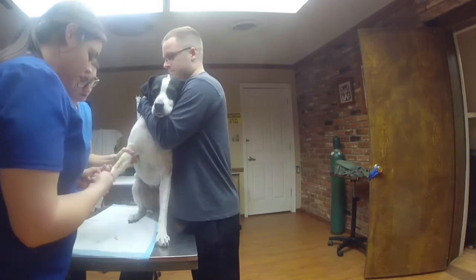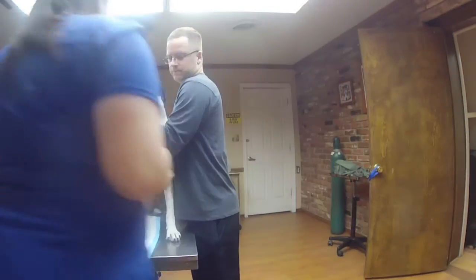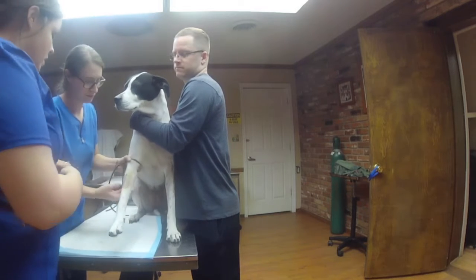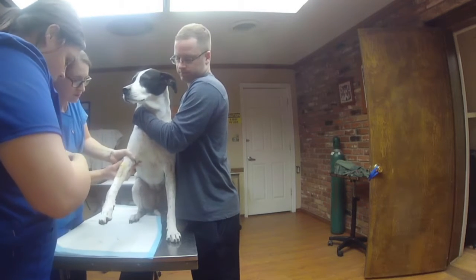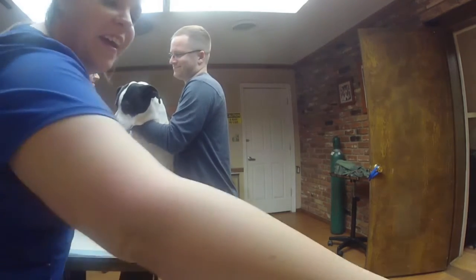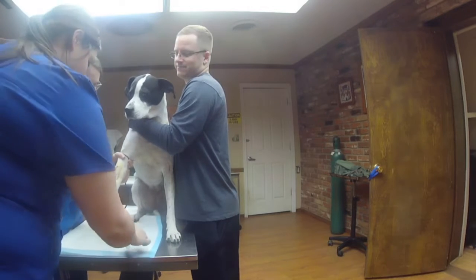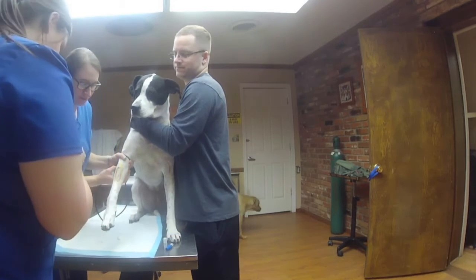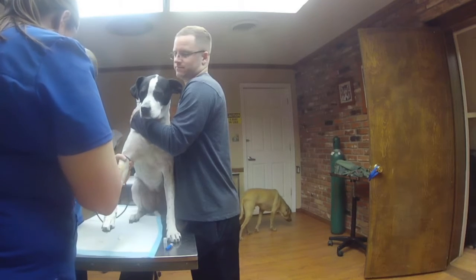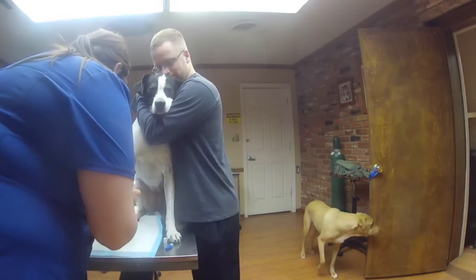Okay. Put the tourniquet up above the elbow. That way we can get a good vein. I have my IV catheter and then the plug for it. Okay, you're going to want to go bevel up.